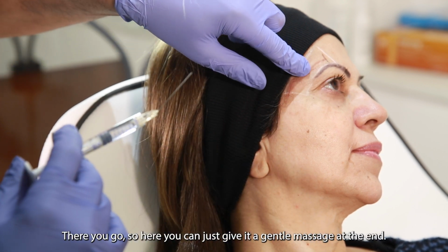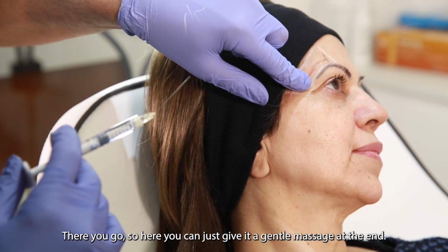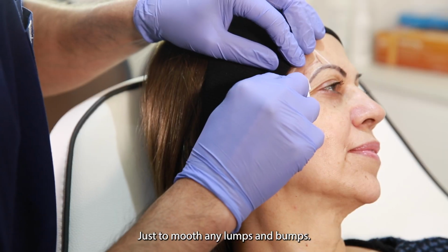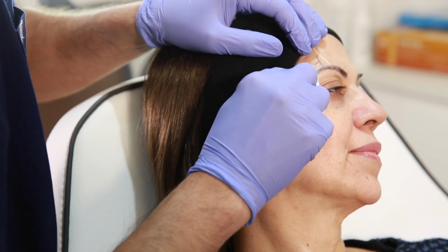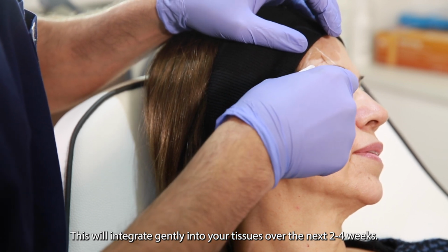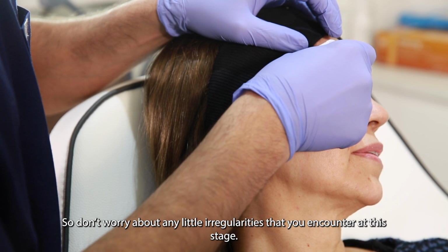There you go, so we've filled all the way to here, a little bit higher. Now we can just give a gentle massage at the end. Just pop this down, see that in action, just to smooth out any lumps and bumps. This will integrate gently into your tissues over the next 2 to 4 weeks, so don't worry about any little irregularities that you encounter at this stage.